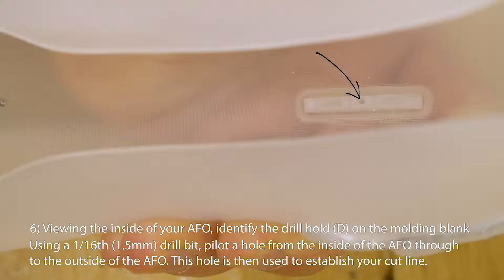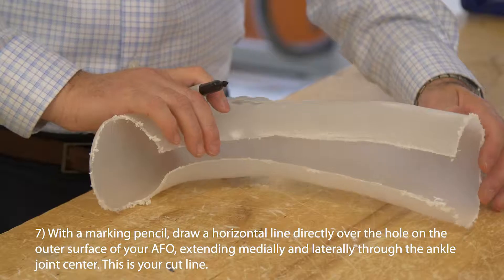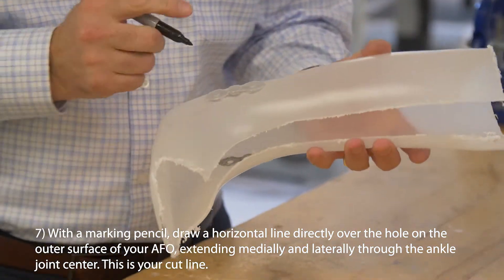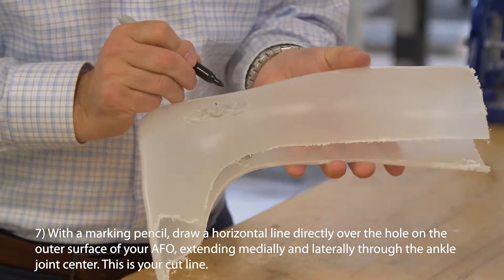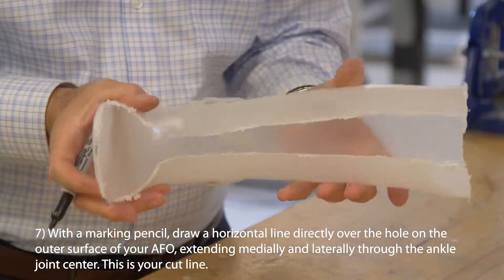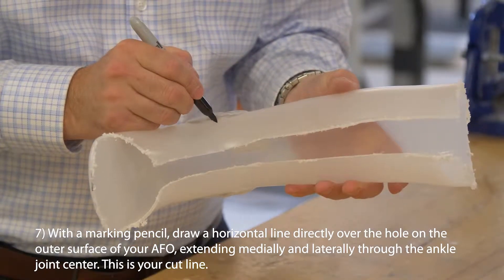This hole is then used to establish your cut line. With a marking pencil, draw a horizontal line directly over the hole on the outer surface of your AFO, extending medially and laterally through the ankle joint center. This is your cut line.